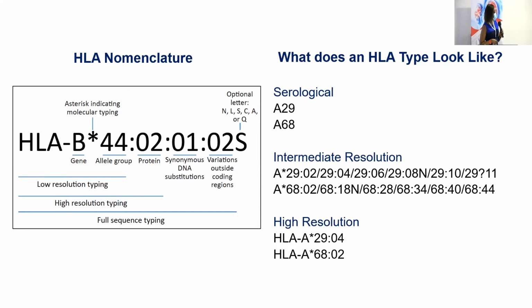Serological will just give you the allele. For the PCR-based typing, it can give different proteins, but it's not enough to differentiate, for example, 2902 from a 2904 or a 2908, okay? So it gives a string of alleles. However, secondary panels can be added to the SSO and SSP typing to enable high resolution. For the sequence-based typing, it's very exact. It gives you the actual protein.